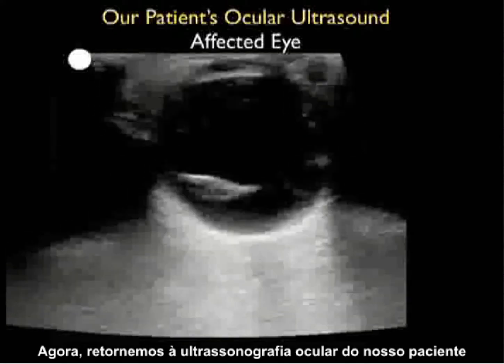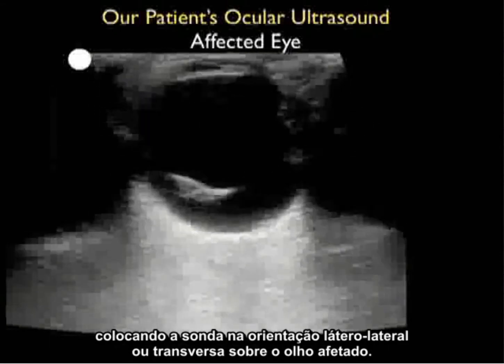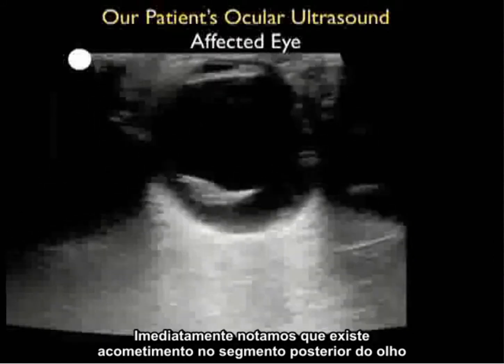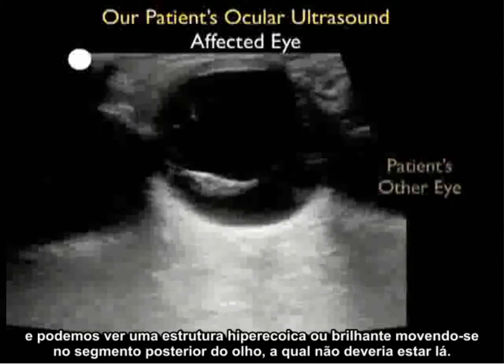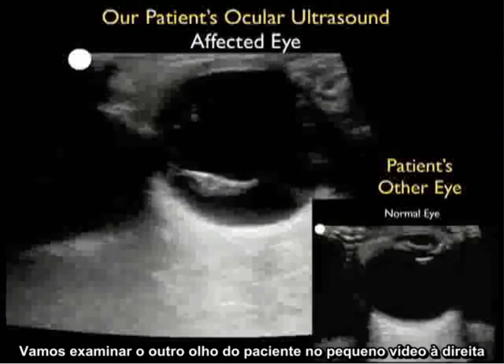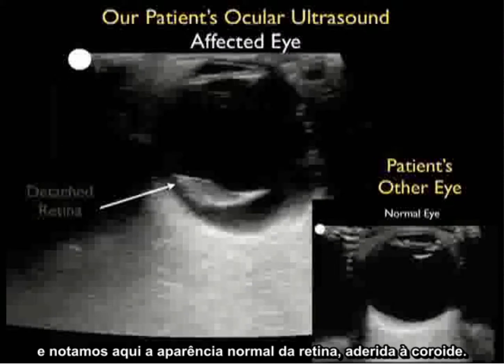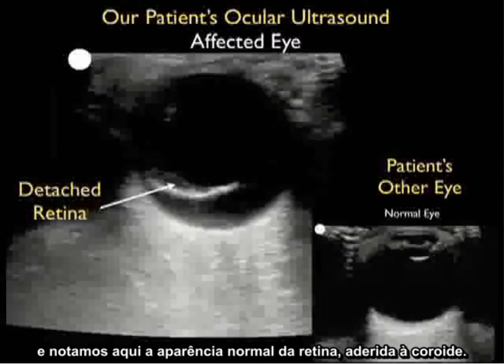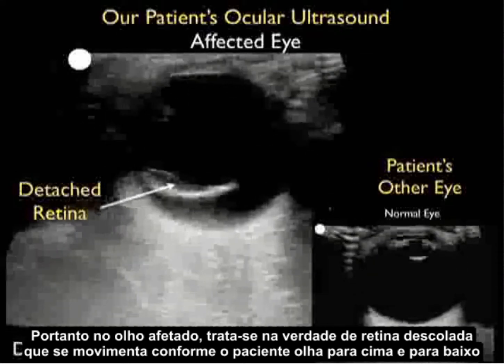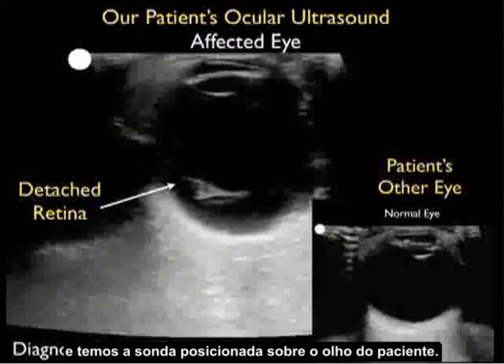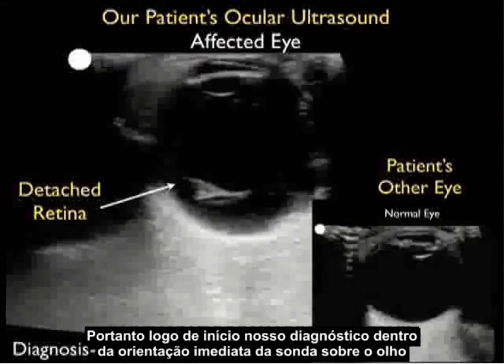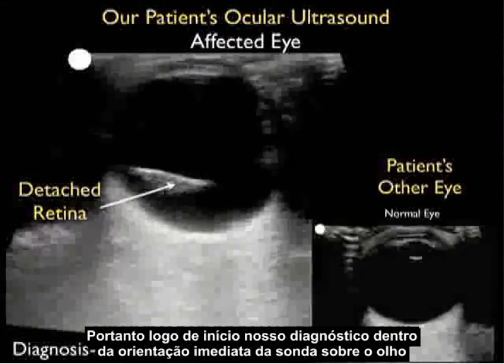Now let's return to our patient's ocular ultrasound, placing the probe in a side-to-side or transverse orientation over the affected eye. Right away we note pathology within the posterior aspect of the eye — a hyperechoic or bright structure waving around that should not be there. Looking at the patient's other eye we note the normal appearance of the retina tacked down to the choroid. In the affected eye, this is actually a detached retina moving around as the patient looks up and down. Our immediate diagnosis is retinal detachment.